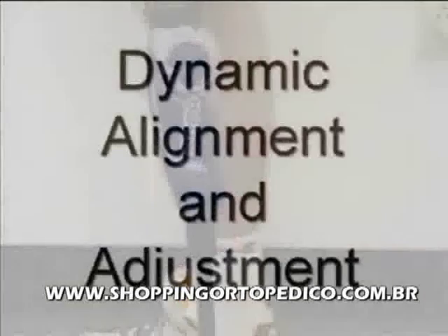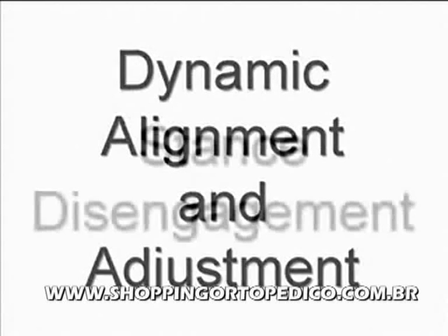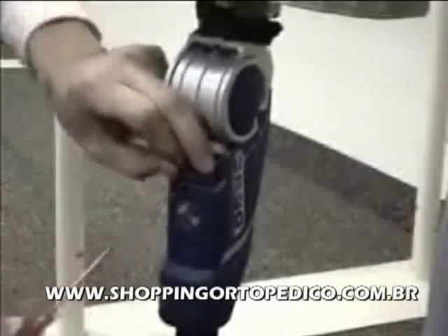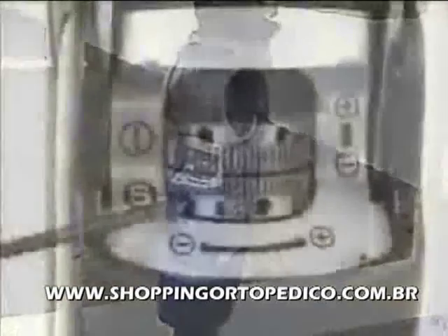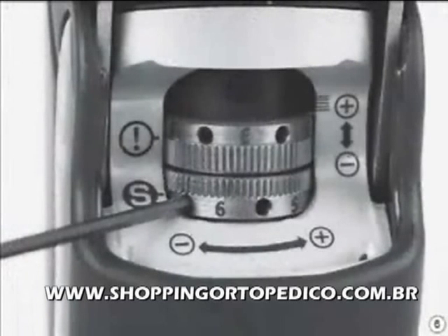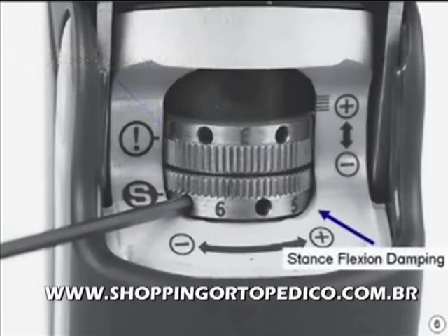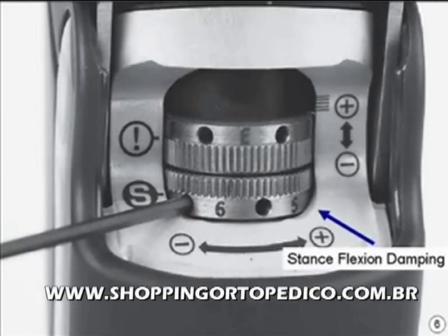After static alignment is completed, dynamic alignment and adjustment can proceed. The first adjustment is to fine-tune the transition from stance phase to swing phase. The adjustment cap should be removed from the back of the knee with a small screwdriver to expose the stance adjustments. The upper ring adjusts the weight-bearing load level required to engage the stance flexion damping — in other words, the sensitivity. The lower ring adjusts the amount of stance flexion damping.